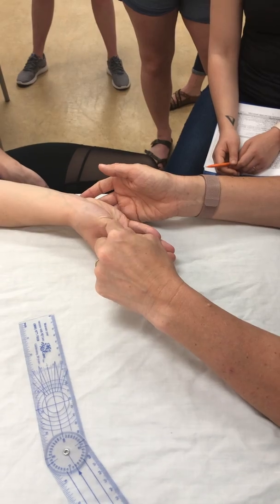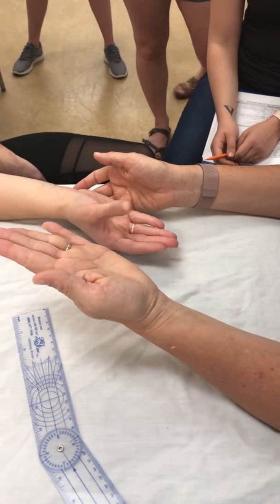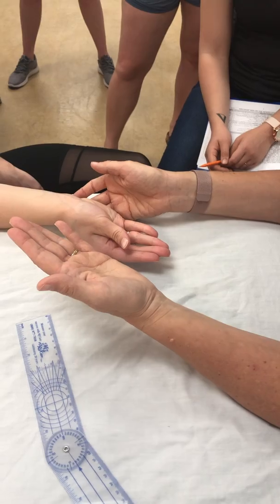Okay, but you can also have her do it actively, but you're going to want to watch this joint, because even now, do you see that she wants to flex her CMC? So that's the one you have to really watch. Like that? Yep. Better? Yep, that's great.